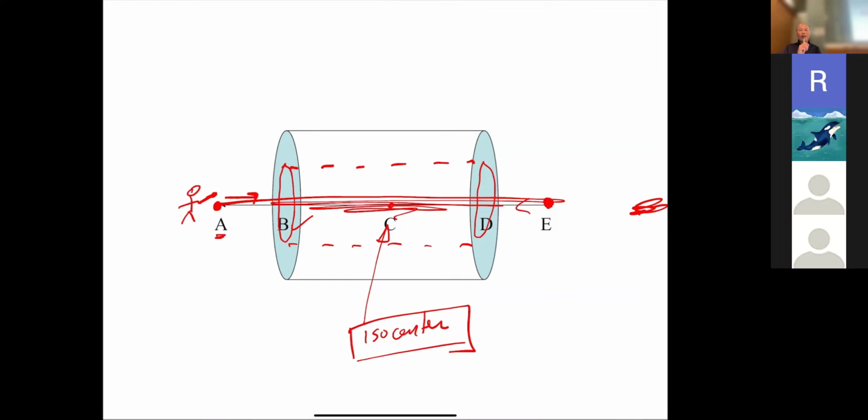Okay. And if you're lucky, it'll go off at an angle, right? If you're not quite in the center, it'll be pulled off and it'll hit the magnet and maybe hit the sides and rattle around and may not come back and hit you directly. But if you're really unlucky, before you know it, your hand will be gone. Okay. Because it will have come back and hit you. I know of people who've had injuries, but luckily they've not lost anything. They got lucky because they weren't perfectly right in the center. But if you're perfectly right in the center, that's what could happen.